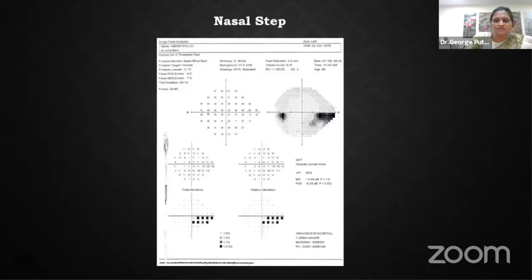In initial early glaucoma, some patients will have scotomas in the nasal field, which is commonly called a nasal step. This occurs mainly because of the horizontal asymmetrical involvement of the glaucomatous nerve fibers.